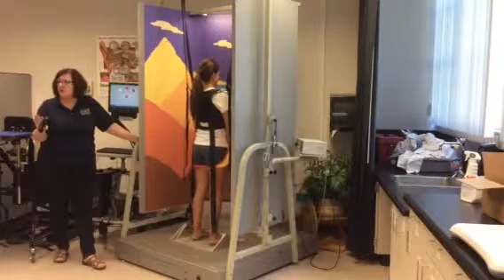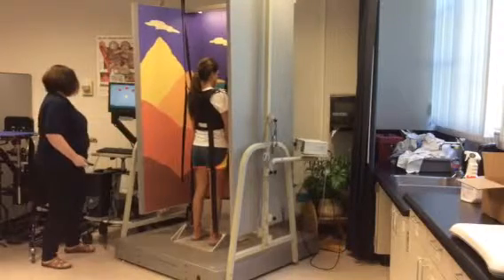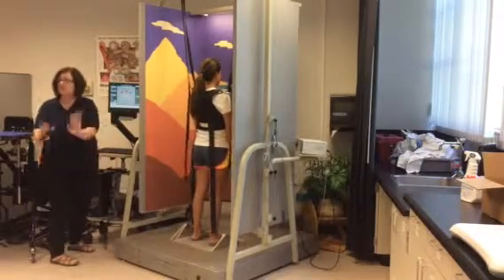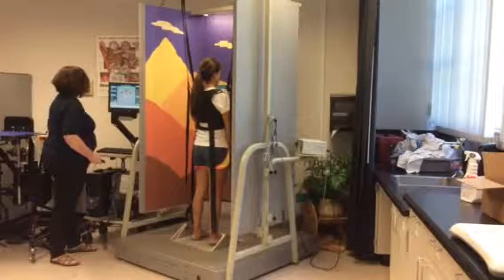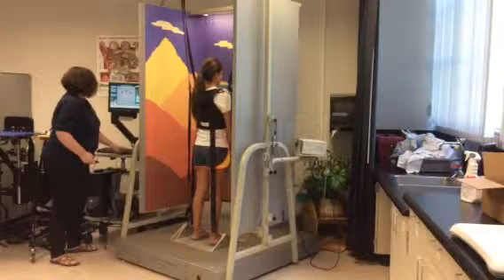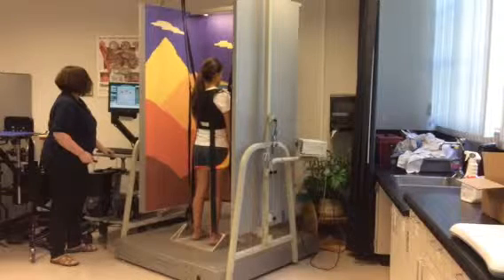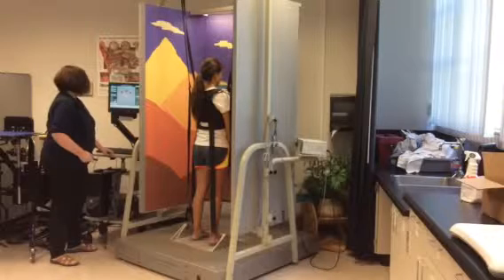So she's making some error, but it won't be long before I push her forward. So I actually have the ability to exceed her capabilities, just like that test. Okay? Watch this. Hang on. I'm going to make it 160% of her sway, which means the surface and the walls are going to move more than she does.